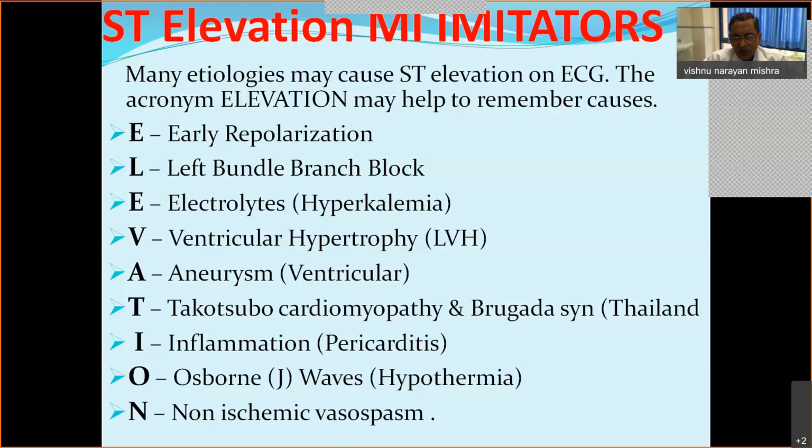and N stands for non-ischemic vasospasm. So this mnemonic of elevation is nothing but the common conditions which are going to be imitators of ST segment elevation. Now I will go one by one to these conditions, and subsequently I will summarize in the last. Now coming from E, that is early repolarization.